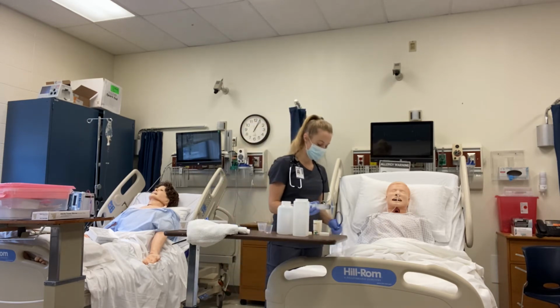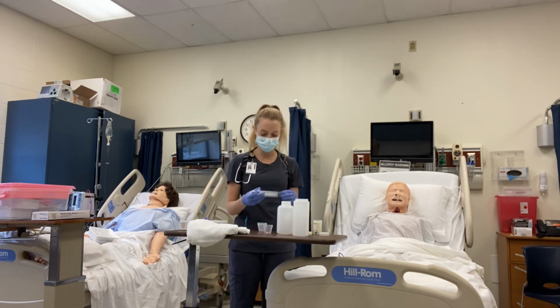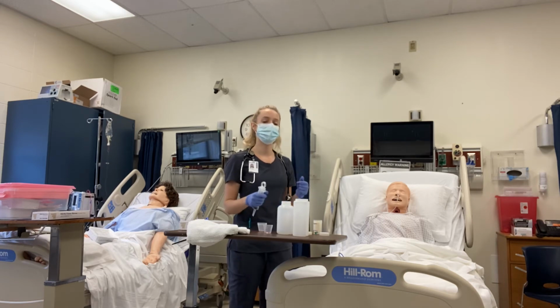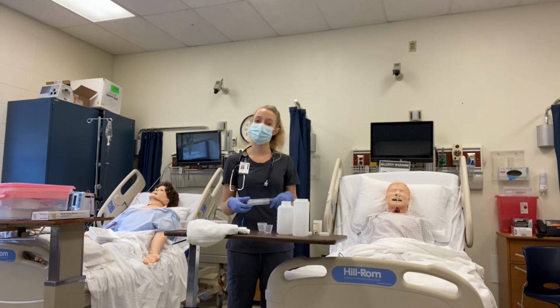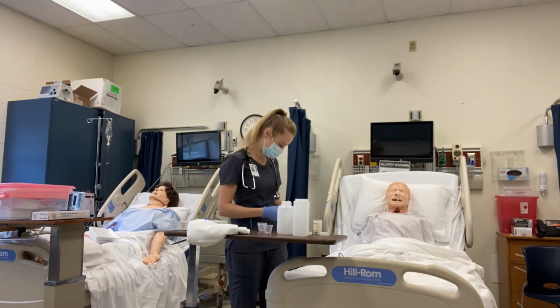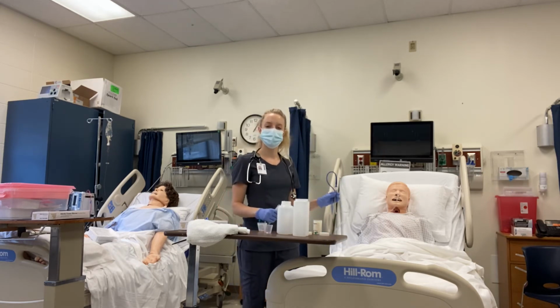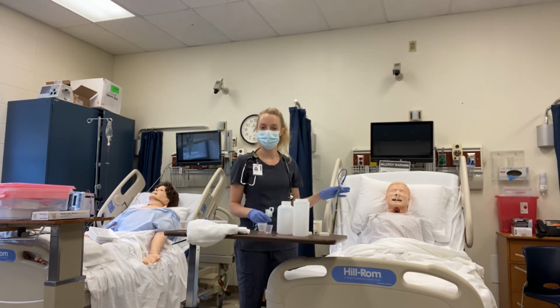Another advantage to this is I can be checking the residual volume. If Mr. Jones has a lot of residual volume in his stomach, it's going to mean that he's not digesting or passing things through his digestive system properly, and I should probably hold that medication. That is up to agency protocol. So we're going to say Mr. Jones has the appropriate amount of things in his stomach and that the NG tube is correctly placed.